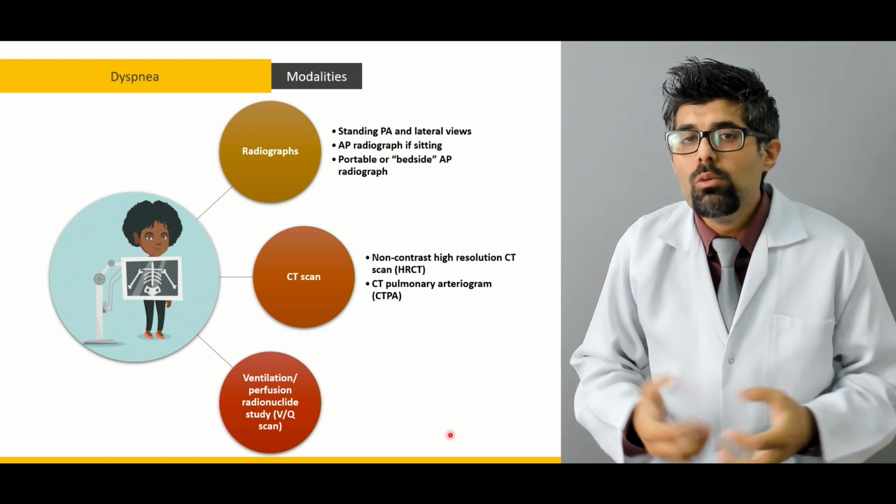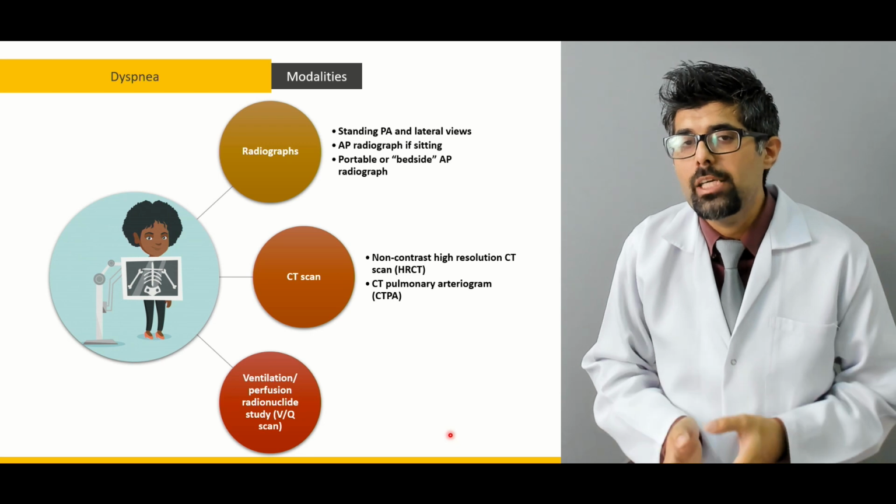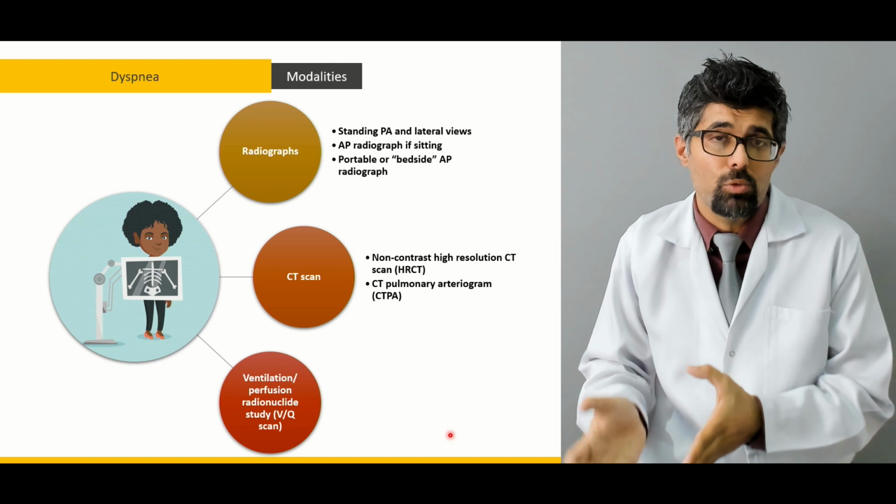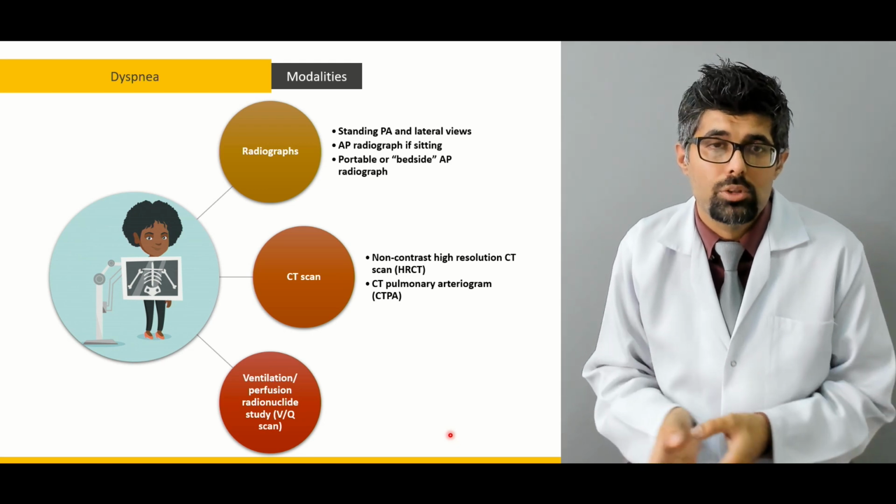But usually what we perform is called a VQ scan in most hospitals, and this is what you will encounter mostly.